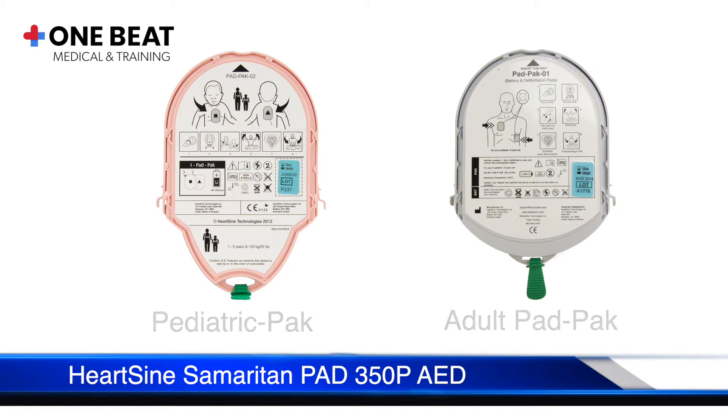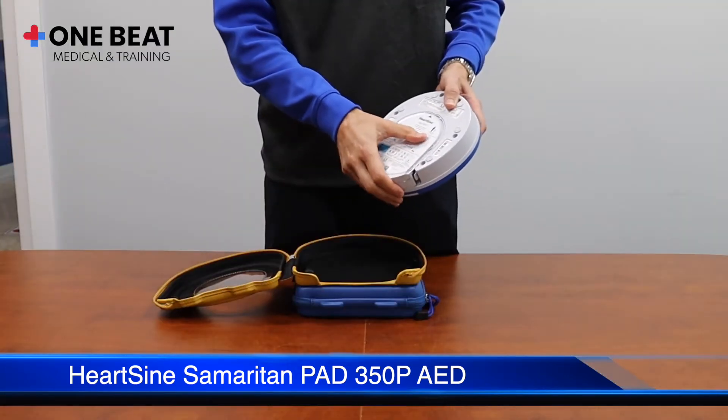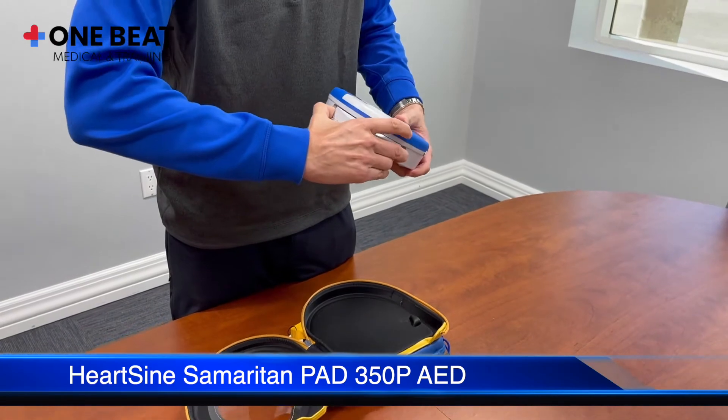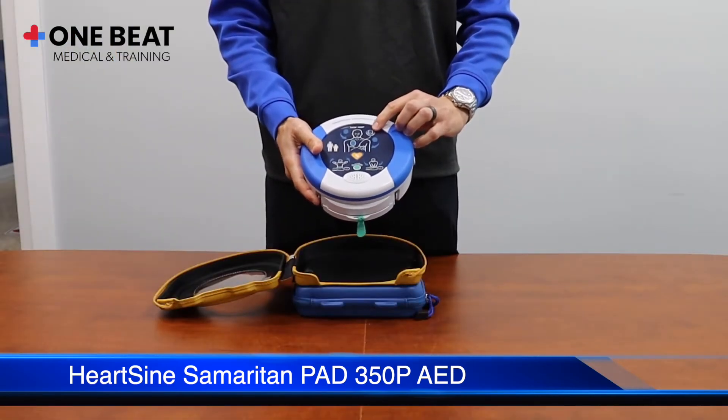Keep in mind that with the HeartSine, the pad pack contains both the pads and the battery. Slide the pads right into position — you will hear it click once it's properly inserted. If you need to remove or replace the pads, just squeeze the tabs on the sides and slide the pad pack out. Once the cartridge is inserted, you will see the blinking green indicator light in the upper right corner.